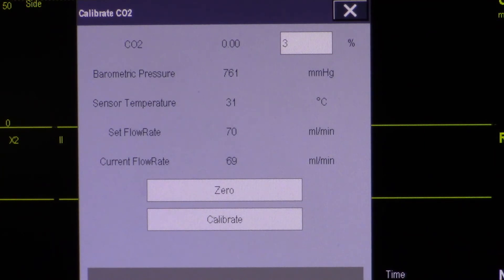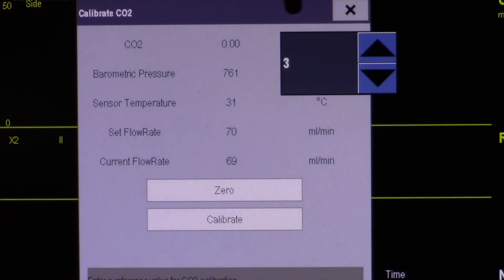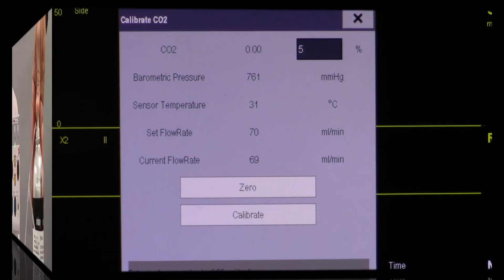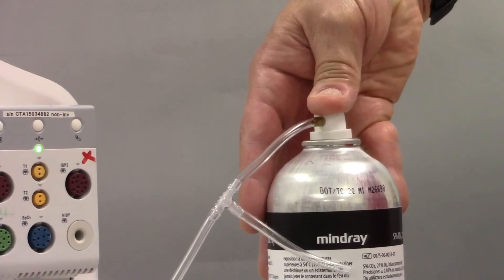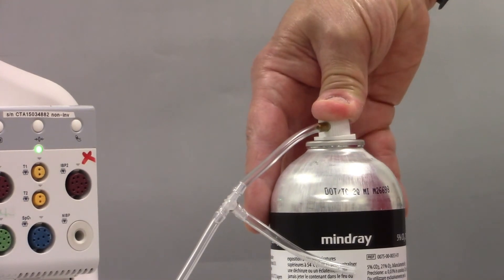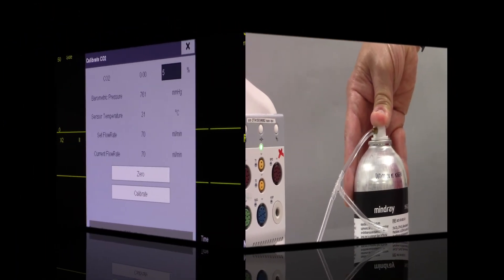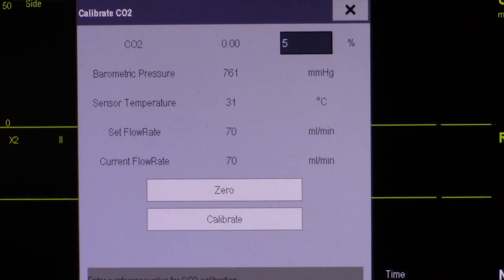The Mindray calibration gas is 5% CO2. To edit the field, touch your CO2 concentration window and select 5. Apply your calibration gas like so. Wait for your CO2 value to stabilize.